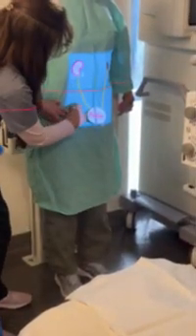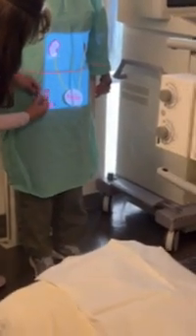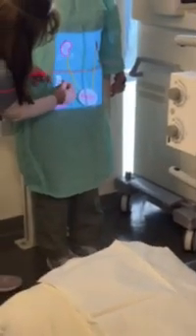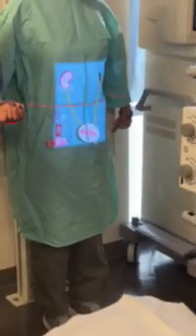Post void, erect, and then erect. See that? Any questions for your post void?